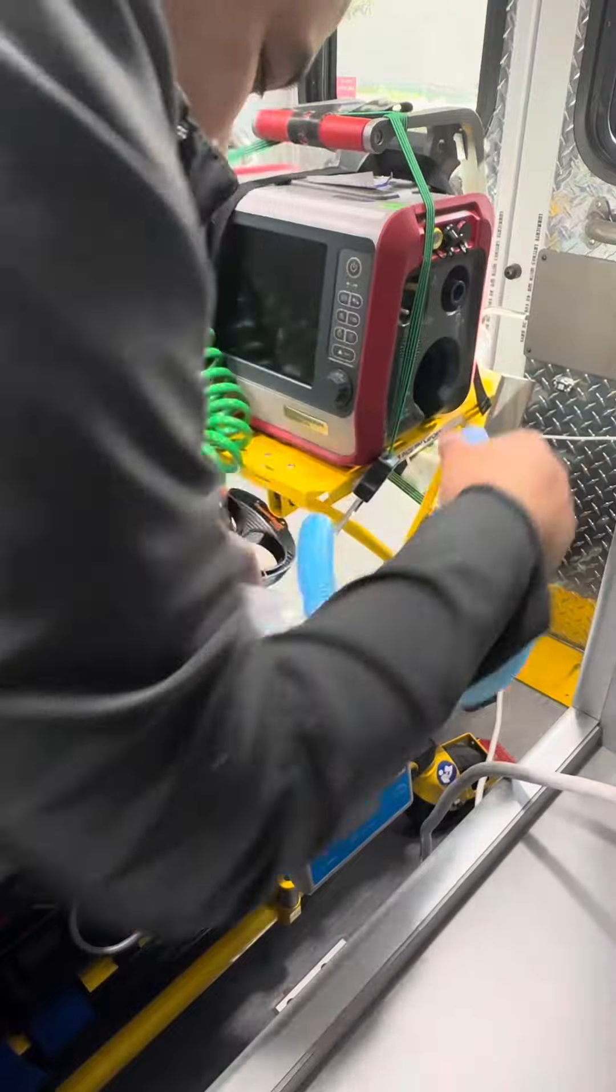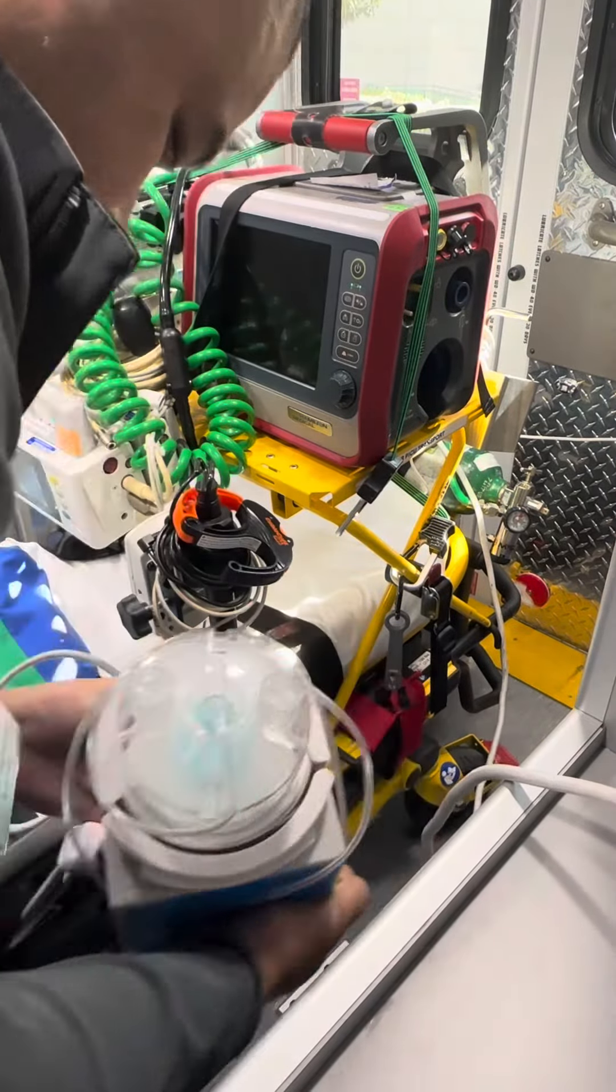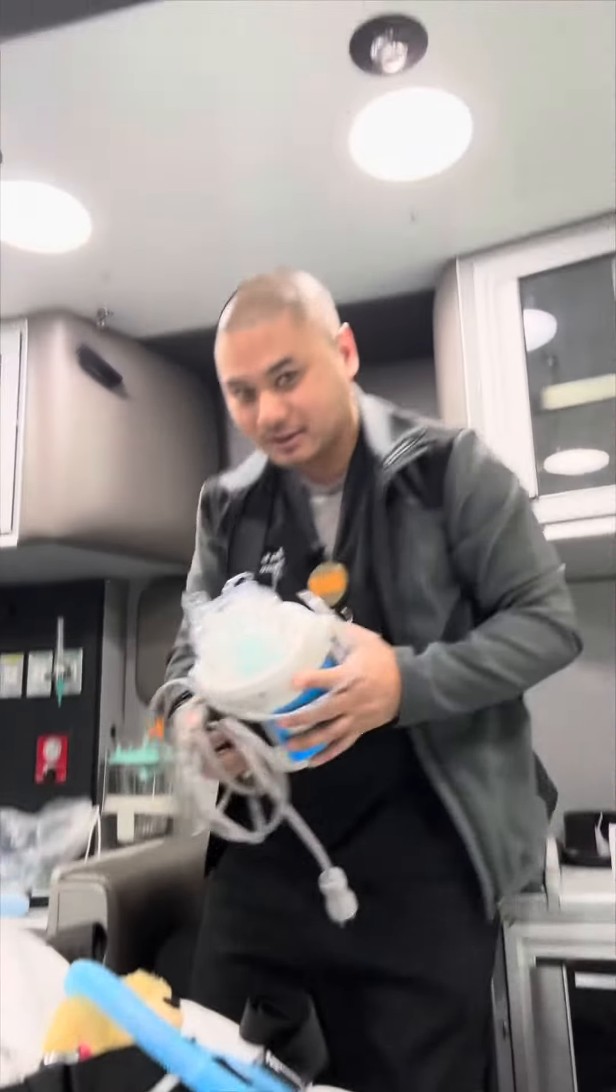When not in use, you're just going to take this out here, slide it out, take the heater and just stick it up here.